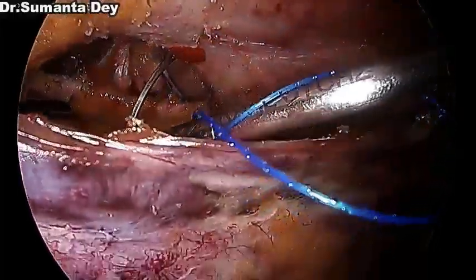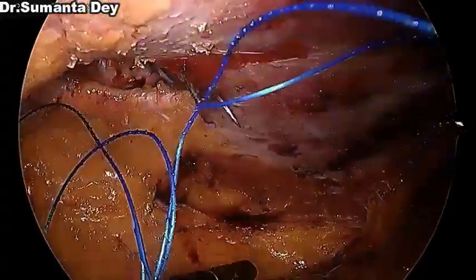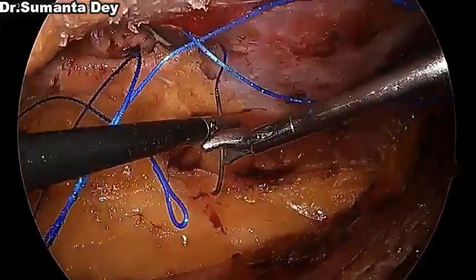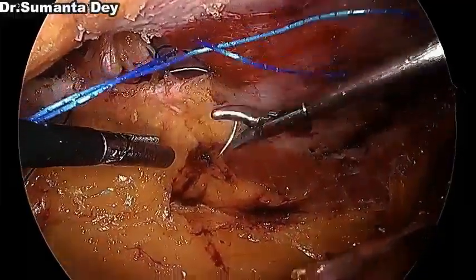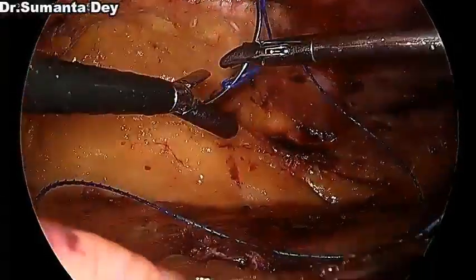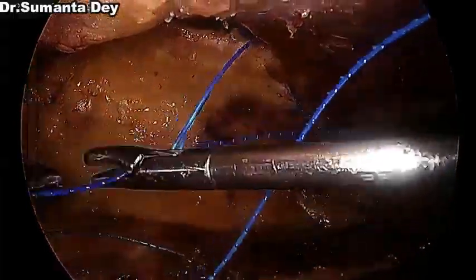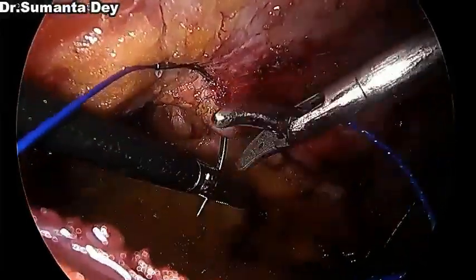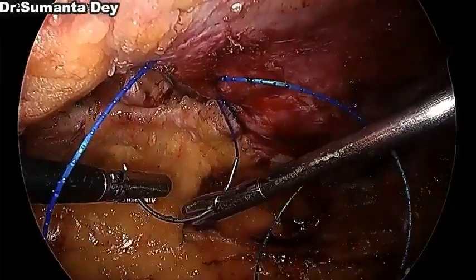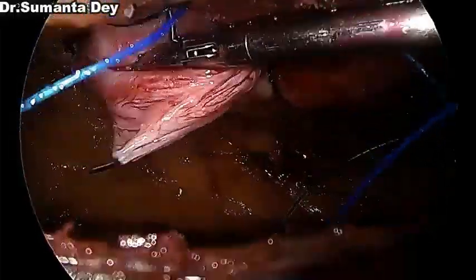Now the next step is to close the hernial defect. So I'm using a number 1 V-Loc suture, a non-absorbable V-Loc suture, starting from the proximal end and going gradually towards the pelvis. For defect closure, I now routinely use barbed suture because I found it very useful. Initially I used to close the defect with polyamide suture or Prolene suture, but later with this barbed suture, I found it very useful and less time consuming.